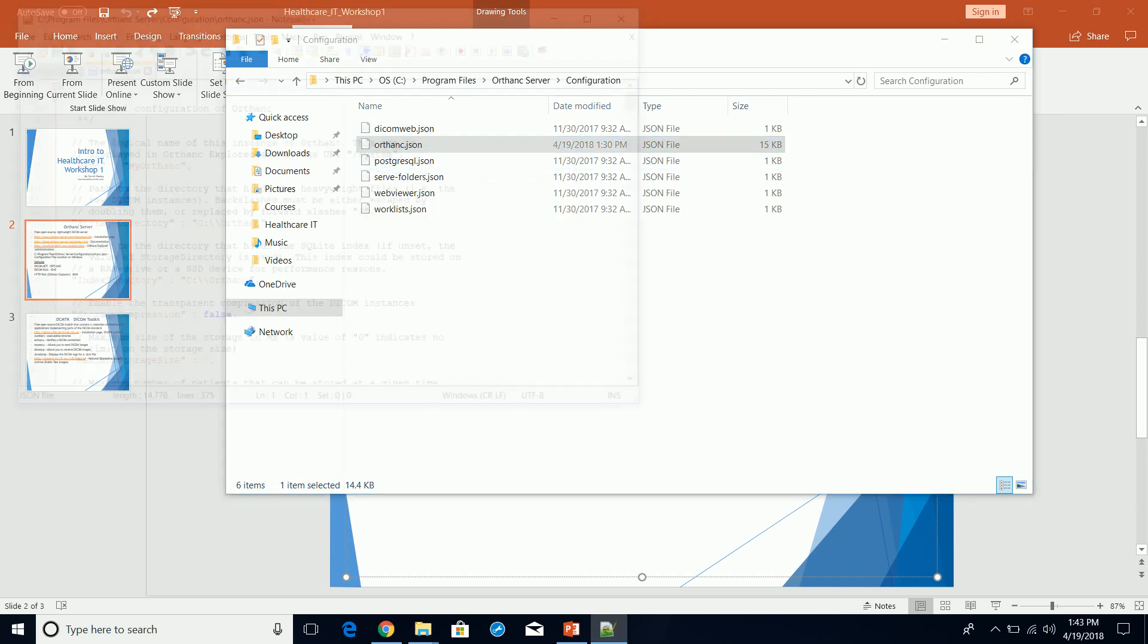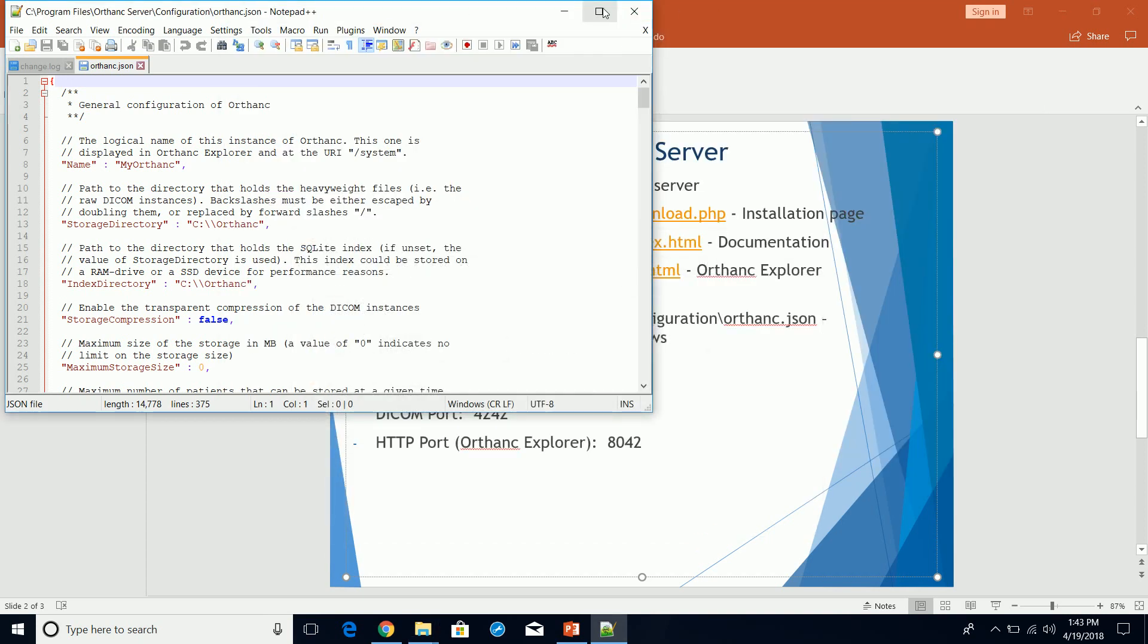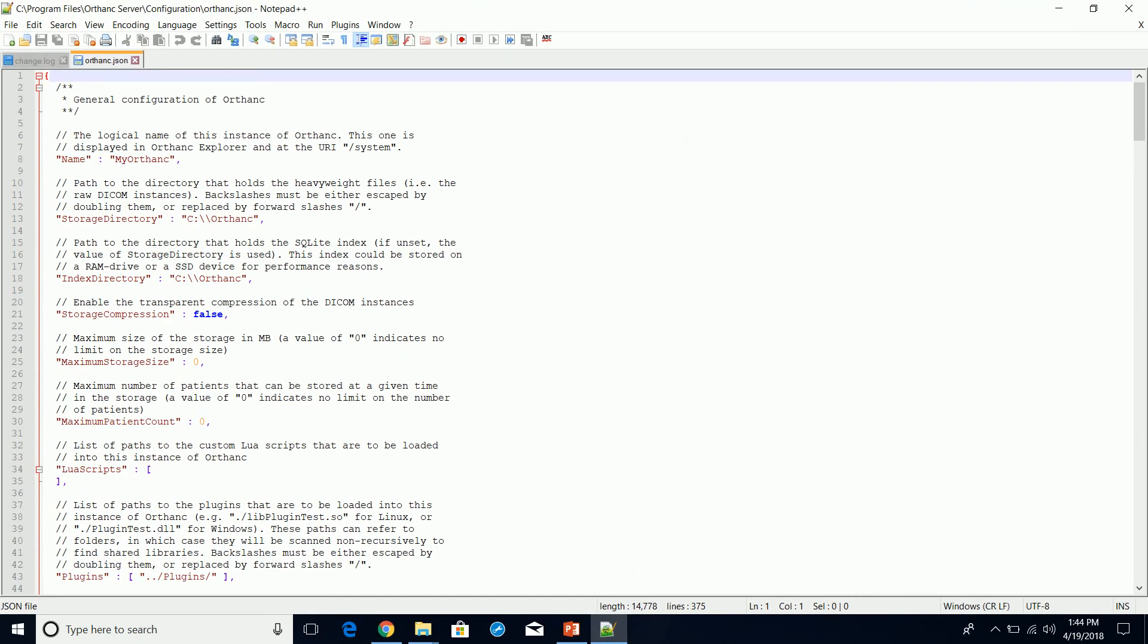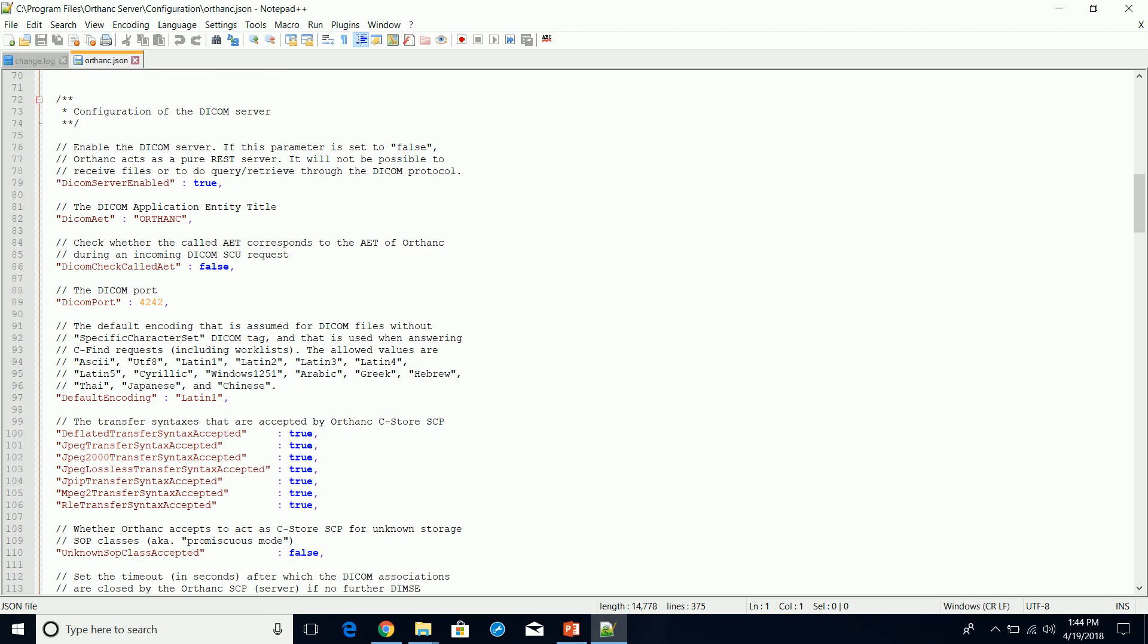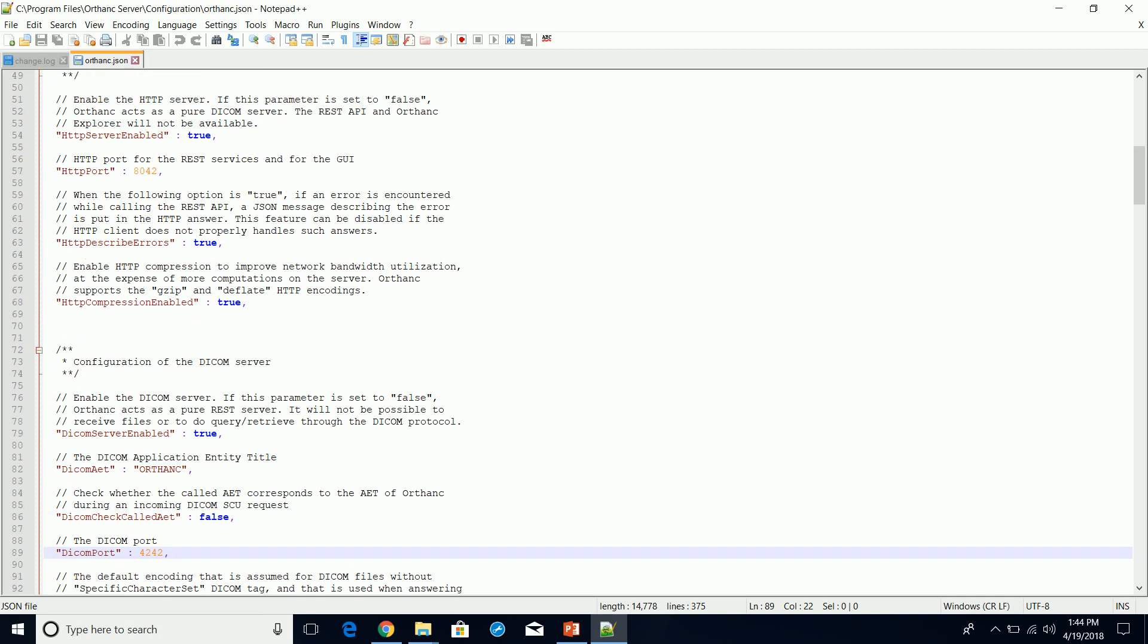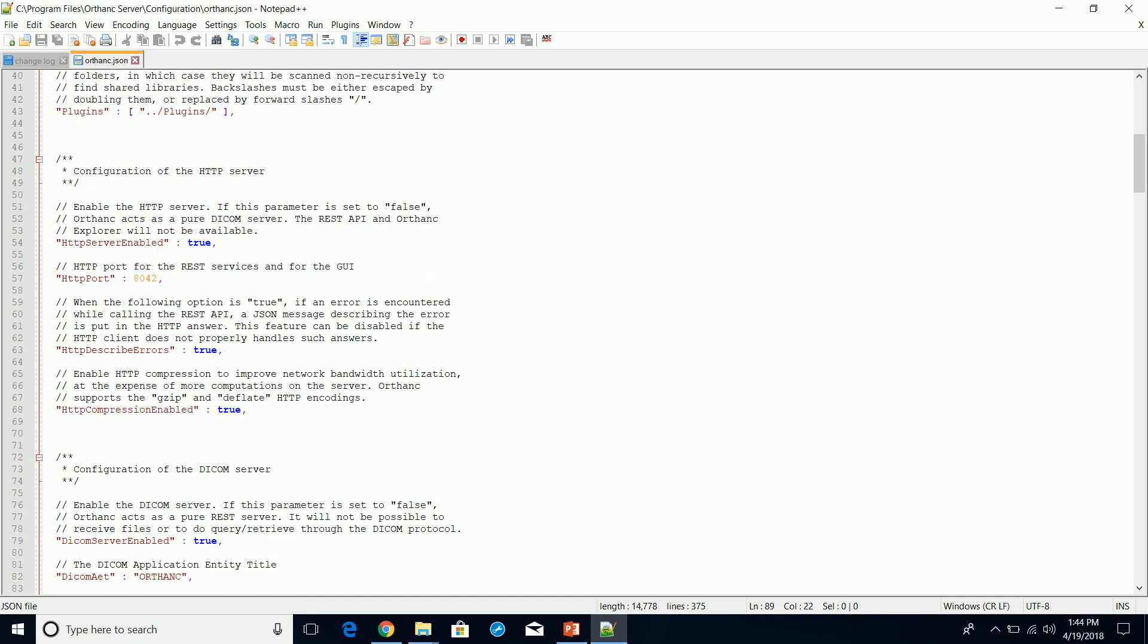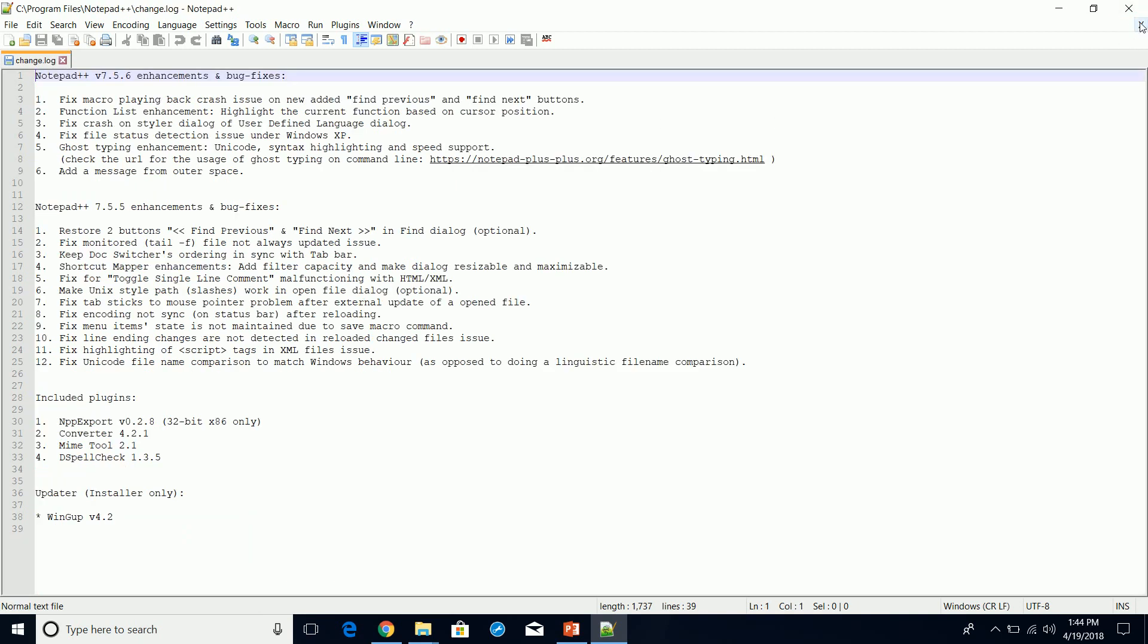We're going to open Orthanc server configuration. It should be this one here, edit with Notepad++. Let's just take a look. In this configuration file, you'll find a lot of information about your Orthanc server, but what we want to look for is the defaults here. You'll find the DICOM application entity title, ORTHANC, and then the DICOM port. We can change these, and we will change these in future videos.